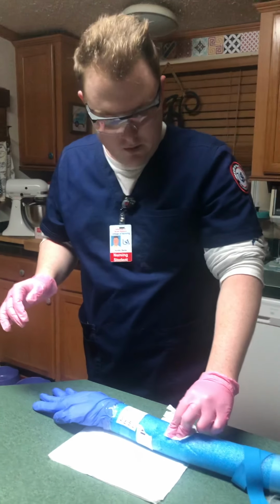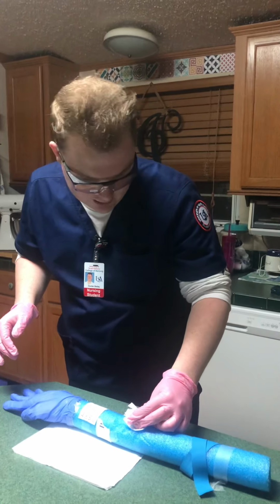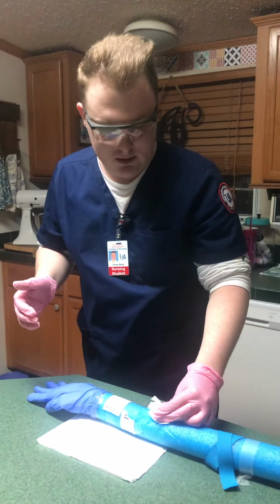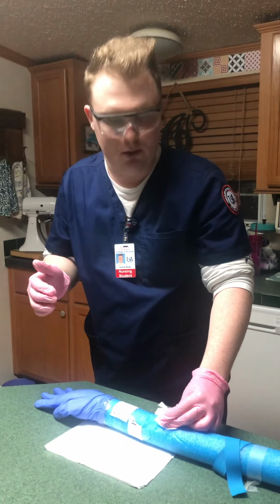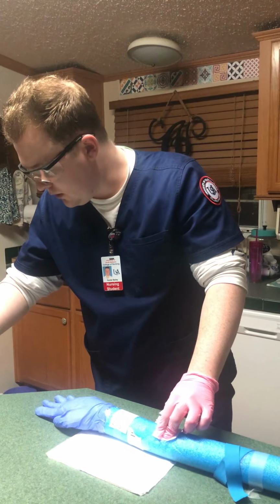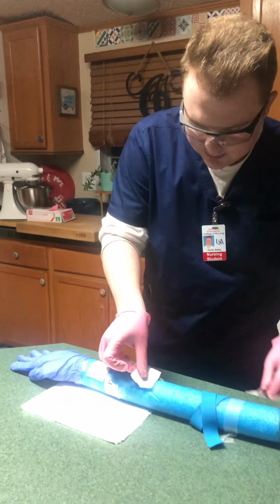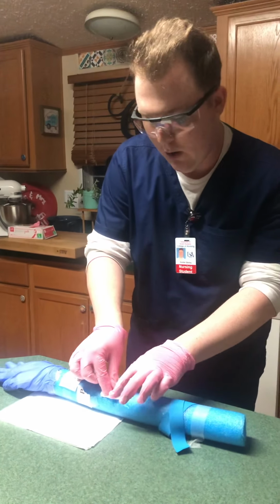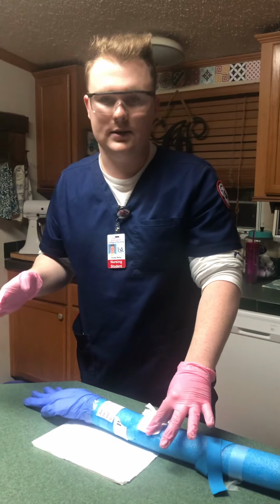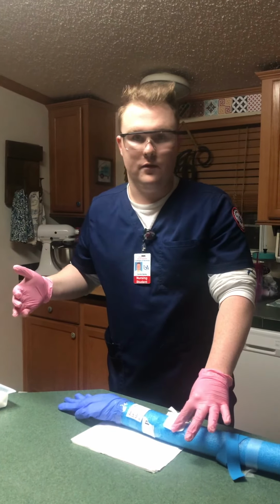Okay, so now that I'm holding pressure on it, I want to look at the site where the IV was in and note if there were any complications, so redness, swelling, draining, tenderness, pain, or bleeding. So now I'm going to get another clean gauze, move this, and when I was holding it, I would apply pressure for up to 30 seconds if needed, but if the patient was on anticoagulants, it could be for a lot longer time.